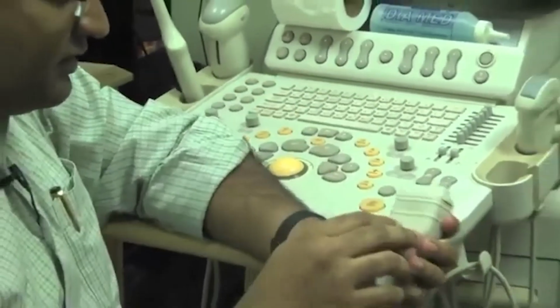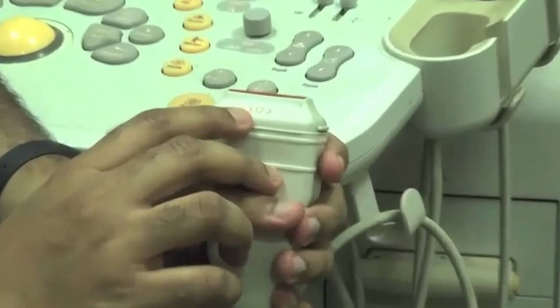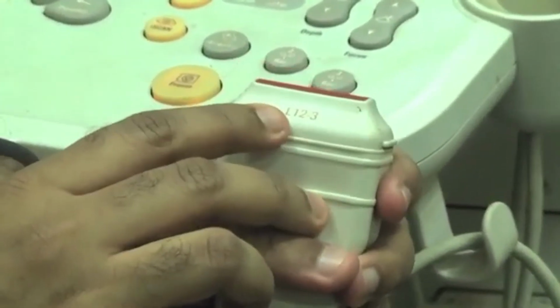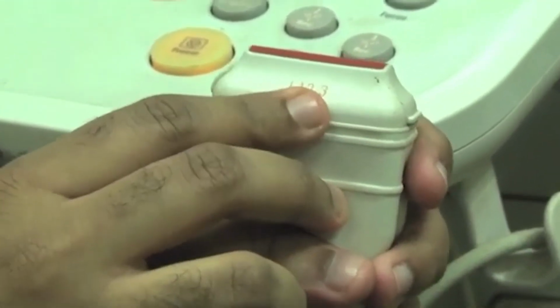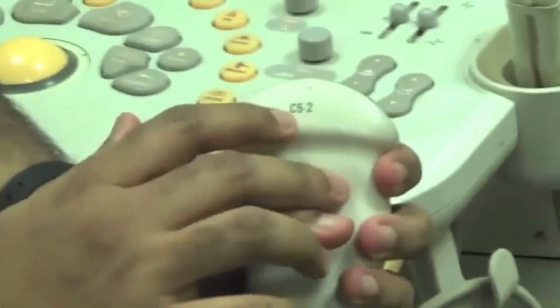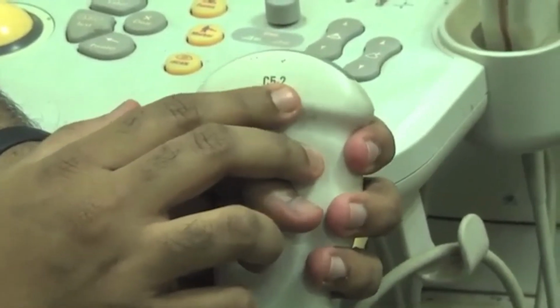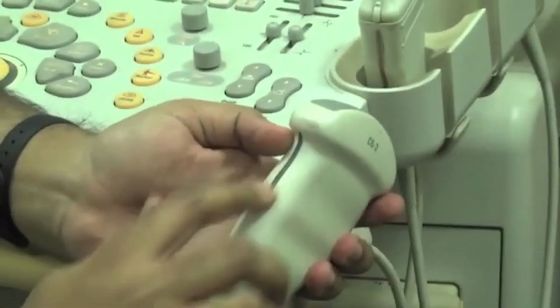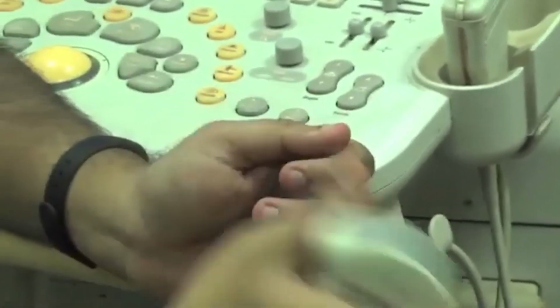Now one interesting thing I would like to show you is the number on this probe. This is L123, which means this is a linear probe of 12 megahertz, and the 3 is a number which specifies the generation or iteration of this probe which was under development. The second probe I would be showing you is a curvilinear probe. This is a C52, so it is a curvilinear probe at 5 megahertz, and the second generation of that probe. You have a similar notch over here which signifies the left side of it, and it's quite an ergonomically designed probe, so that you can hold it very rigidly in your hand.